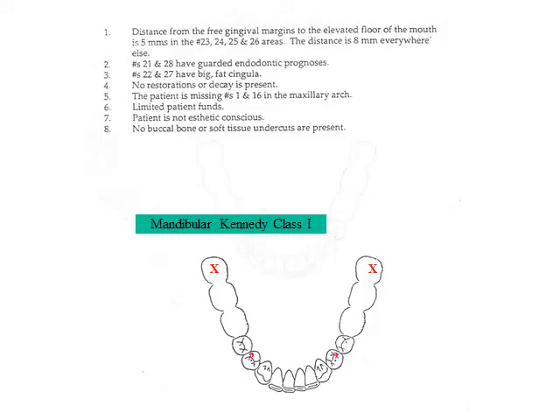No interferences to a path of placement are noted. Contours of abutment teeth are acceptable. There are no bony undercuts or frenal attachments which will interfere. The articulated casts are examined to visualize the amount of vertical space for posterior teeth and rest seat placement.